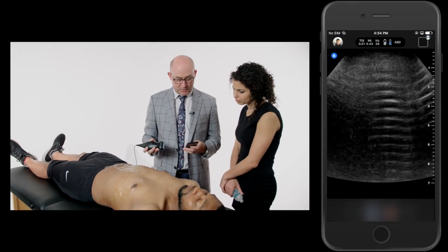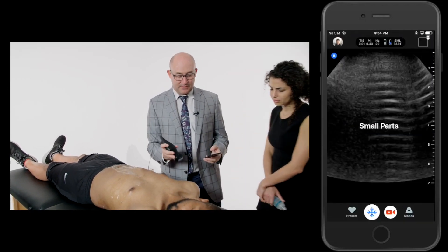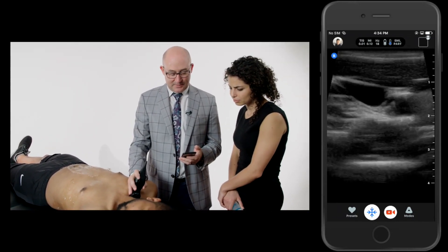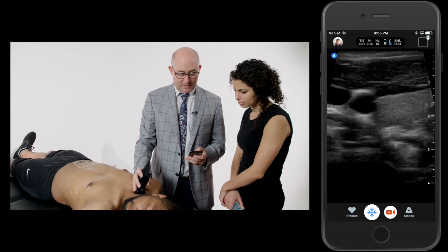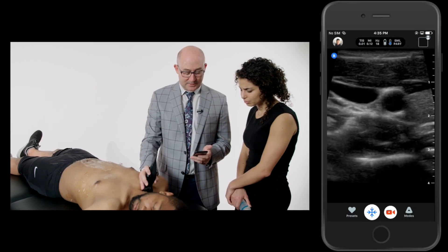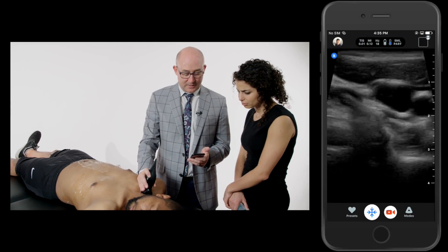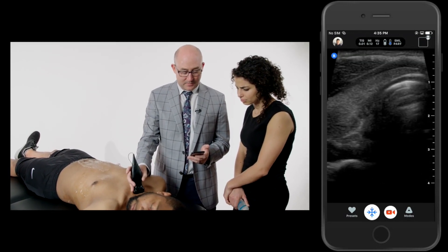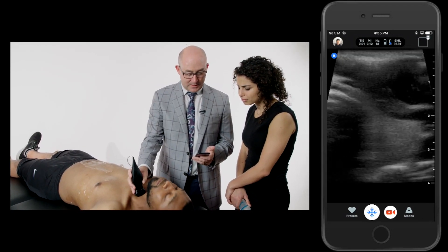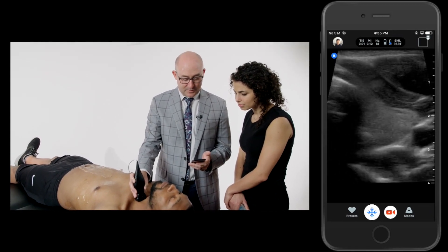From the aorta, I'm going to go look at his neck now. I'm going to change over to small parts. Come up here and take a look at his neck. I like this anatomy here — it's very easy to get to. First of all, I'm looking at his thyroid, fanning through it. We can see the carotid next to the thyroid and then the IJ over here. The IJ is easily compressible as I move through it. Here's your thyroid, the isthmus of the thyroid, coming across right on top of the trachea. And as I come over here, we can see all the strap muscles there in the neck. I can see his left lobe of his thyroid as well.